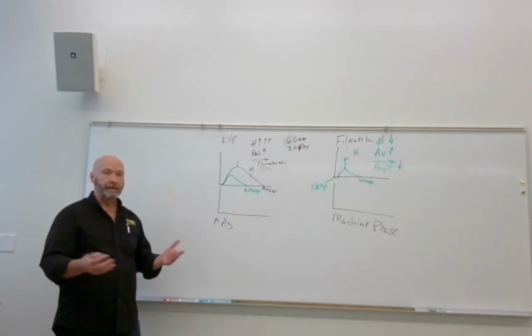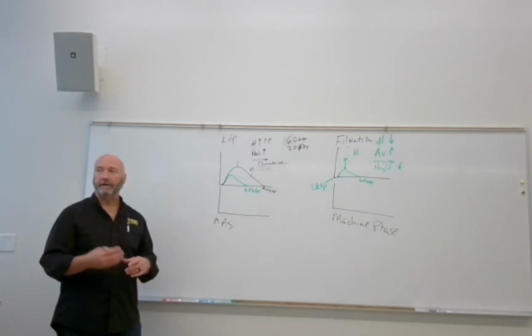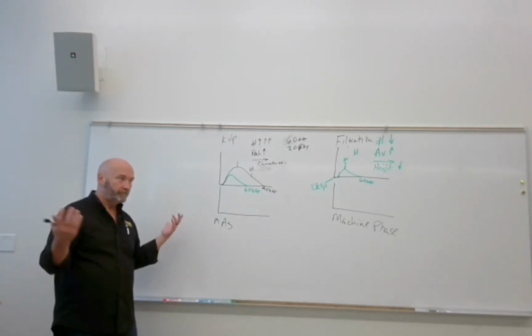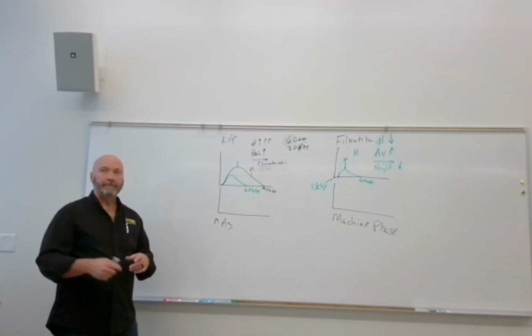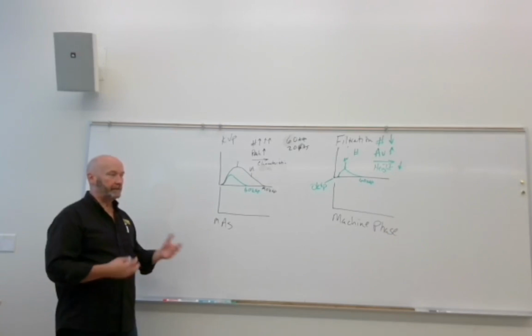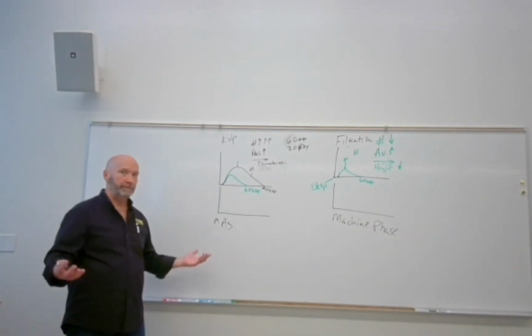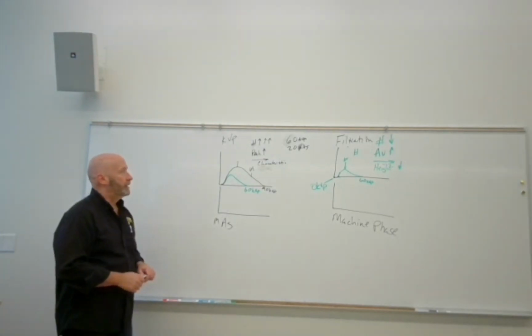So for a KUB, let's say, for an asthenic patient, it may say 80 kVp, maybe 85 for a hypersthenic patient. So you see it a little bit, but I think it'll become more prevalent. I think it'll eventually be the technique of choice for adjustment for patient thickness or whatever, because it just doesn't affect contrast all that much anymore.